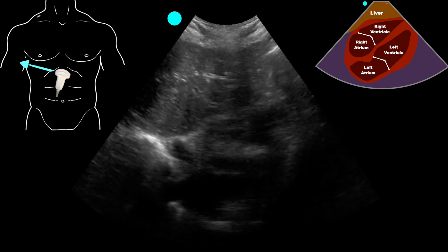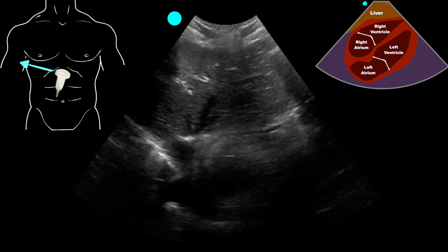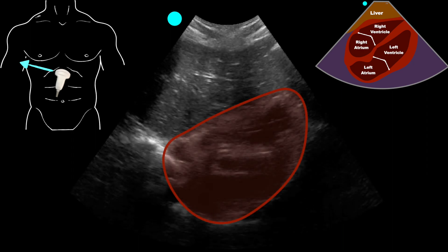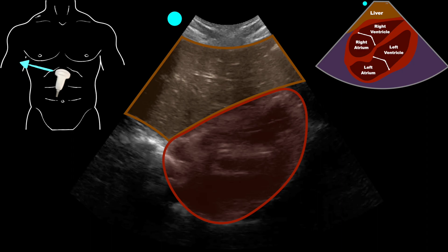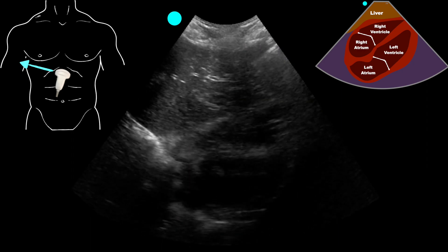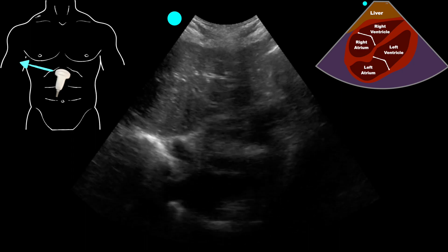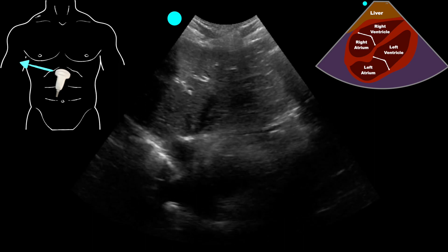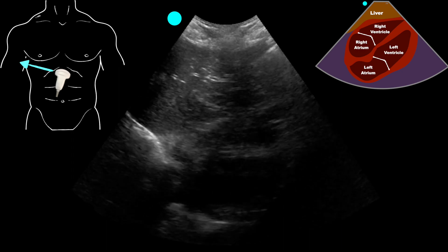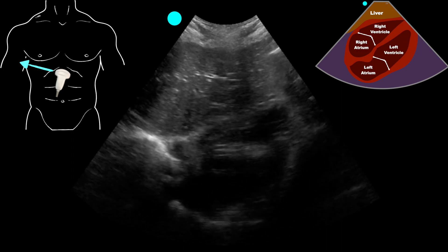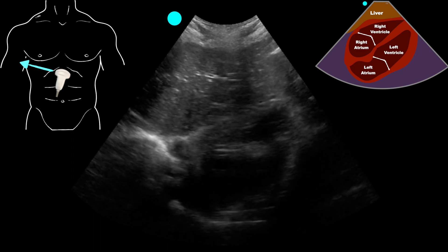We're going to move on to a sub-xiphoid view in somebody in respiratory distress with borderline blood pressures and evaluate the heart. What we see here is the heart with the liver sitting just above it. Those two structures are right up next to each other with no space in between them, so there is no pericardial effusion. It's hard in this case to determine the function of the heart given the limitations of the curvilinear probe — you could change to the phased array or cardiac probe — but it does look generally okay and appears to have good function, so we'll move on.